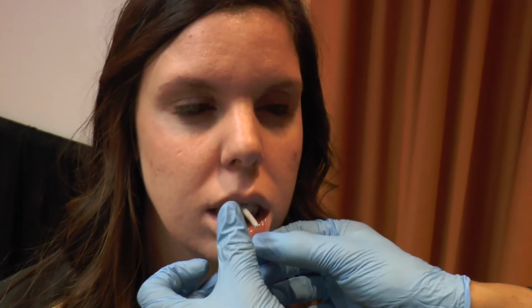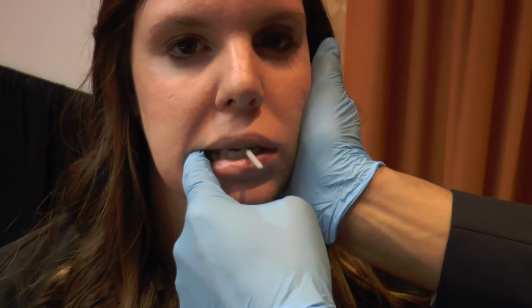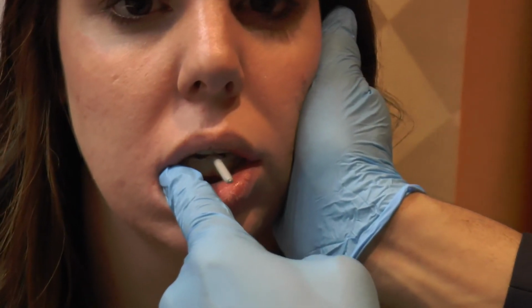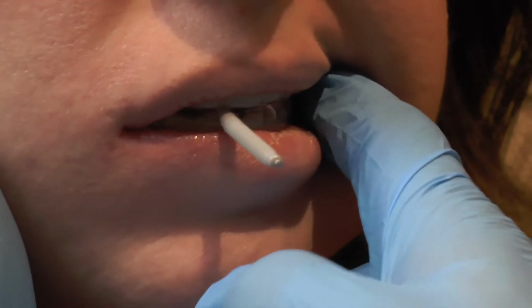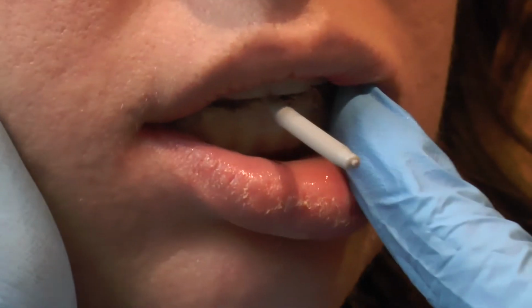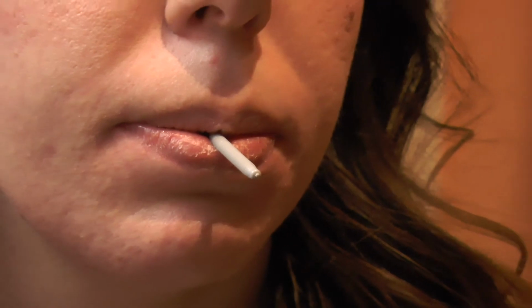So about a minute in, you want to take a look at this tray just to make sure that you can start seeing that it starts changing towards that whiter tone. And you just want to, with some passive pressure, adapt the tray so it molds into the buccal walls both on the right and left side for better adaptation and retention. And there again, as pointed out earlier, if retention is poor, you just repeat this step by placing it back in some warm water and refitting and remolding it.